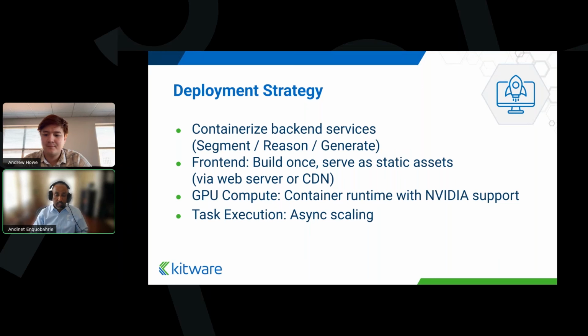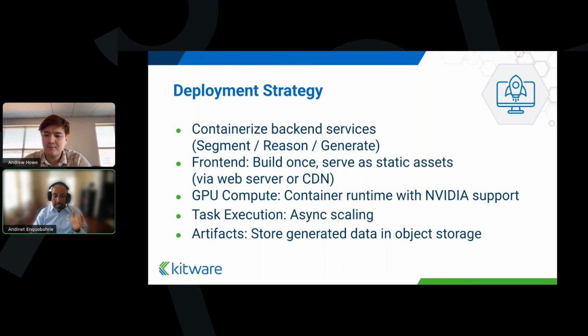One thing we haven't done yet, but it's so important, is, let's say you are running several segmentation tasks or generation tasks. How can you asynchronously scale up the resources available for all those different task executions or different sessions? Having a way of brokering the tasks versus the requesting sessions will be critical.